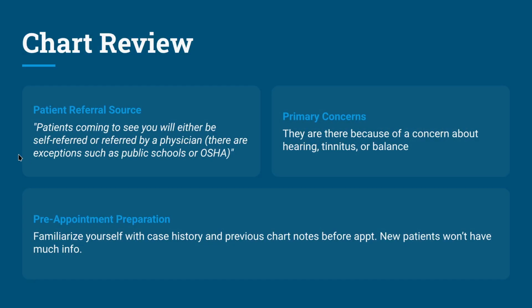Before you see the patient, you want to review the chart for the patient. So you want to see the referral source. Why is the patient coming to see you? Who has sent the patient to come see you? Are they being sent to you by a physician? Are they being self-referred? Are they just scheduling the appointment on their own?